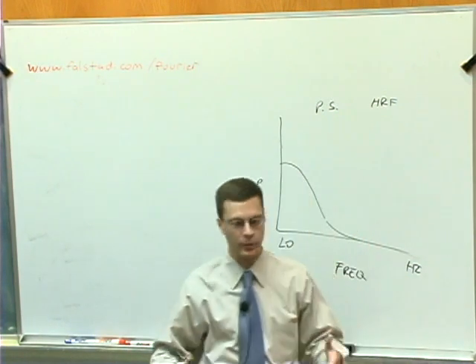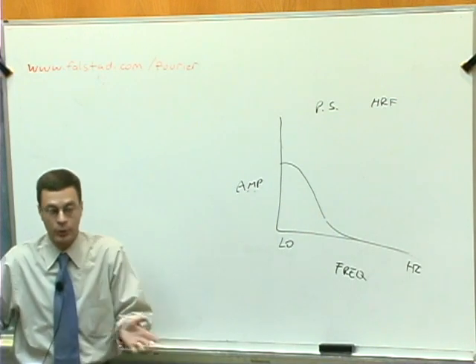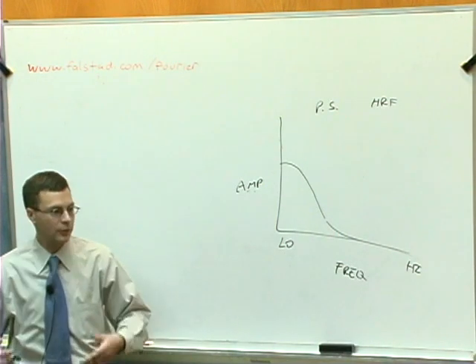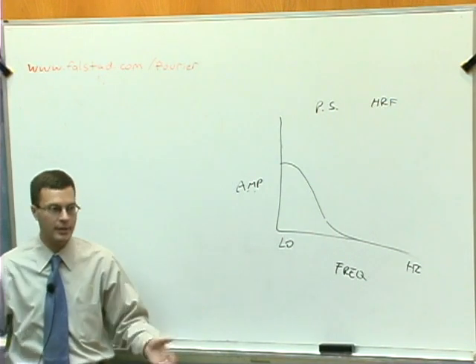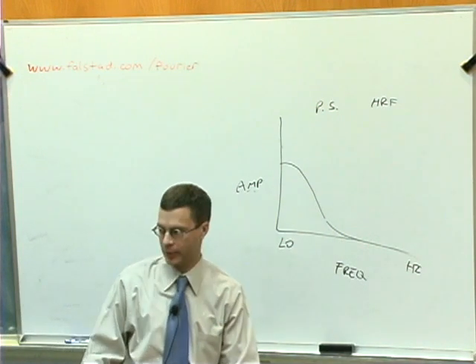So with that knowledge, that would give you some information about what would be the best sort of fMRI experimental design that you'd want to use, right? Knowing that very fast changes in neuronal activity don't get represented very well in the bold fMRI signal, and remember, your whole goal here is to detect a change in the bold fMRI signal, maybe what we should do is design our fMRI experiments so that they're predominated by slow changes in neuronal activity, right?